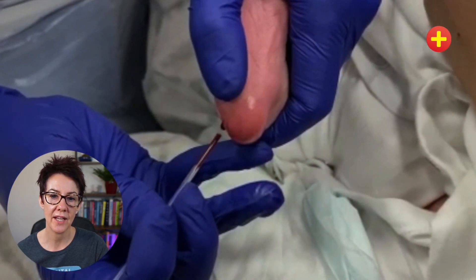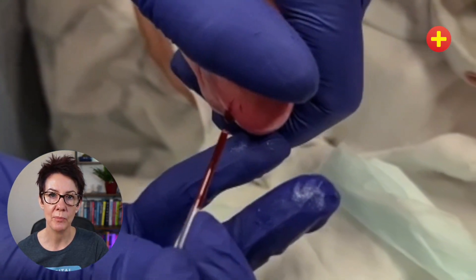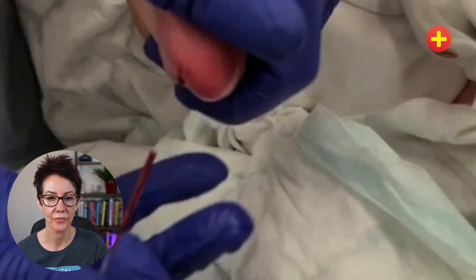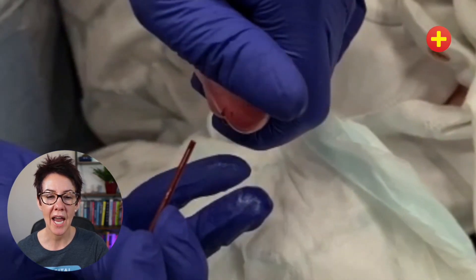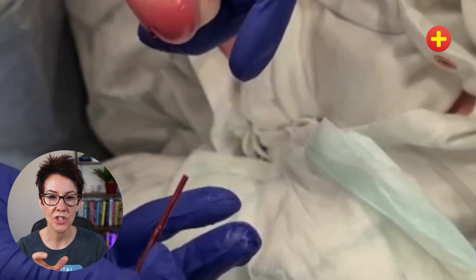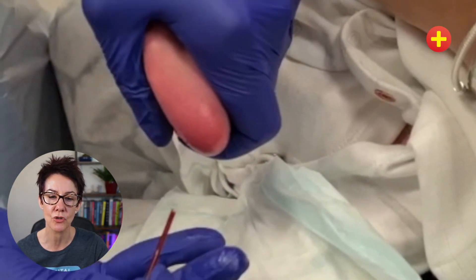Use your thumb to dorsiflex the foot and then allow it to relax. Each time you dorsiflex, you'll see a new drop of blood forms and you can just collect it in the tube. Make sure you keep the capillary tube pretty much horizontal because you don't want any air bubbles in that tube or the sample won't run. You can just gently rock the tube backwards and forwards to make sure the blood you've already collected is at the end of the tube before you pick up the next drop.